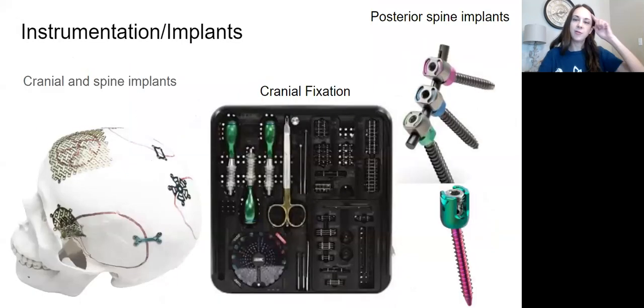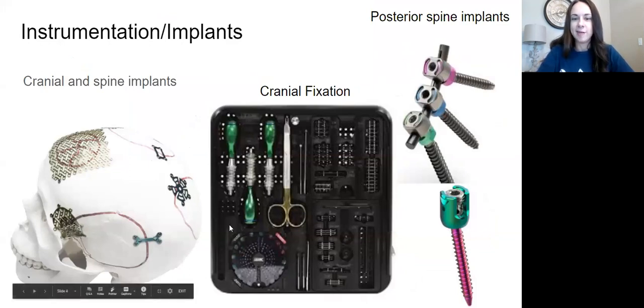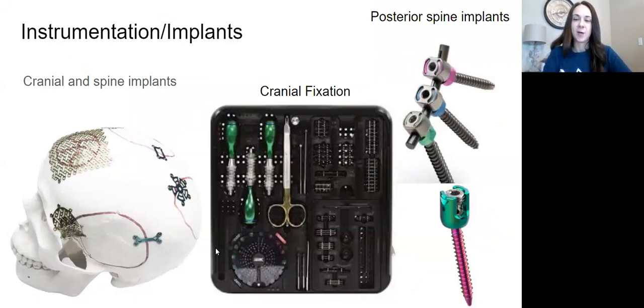Okay, after that, I went into the different implants you're going to see, which is just my favorite. So you guys know I have a skull in my office, so I've had lots of practice with this cranial fixation tray. This is just one. This is Lorenz. So you can see that it comes with lots of different options for plates right here, and then not a whole lot of options for screws because they don't need a lot of options. They typically do 4-millimeter screw throughout because it's the same thickness of bone, same kind of bone throughout.